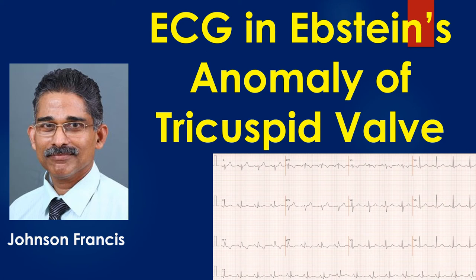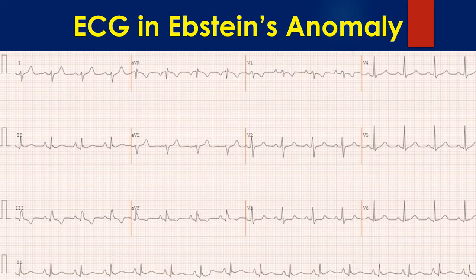ECG in Ebstein's anomaly of tricuspid valve showing right axis deviation of QRS. Notched R waves in leads 2, 3, AVF, and V1 suggest fragmented QRS. Peaked P waves indicate a right atrial abnormality, though the typical voltage criteria for right atrial enlargement of more than 0.25 mV is not satisfied.